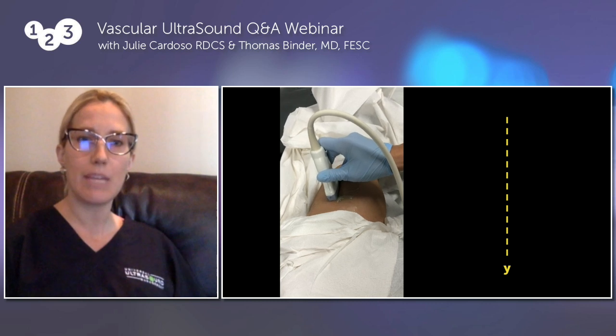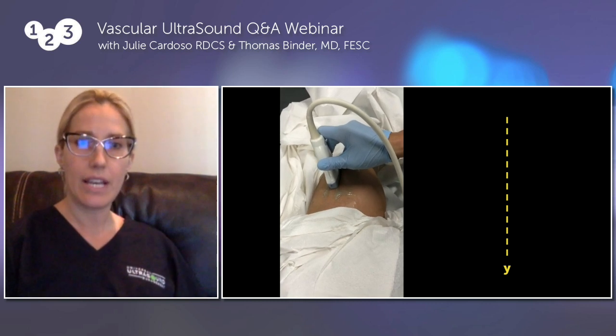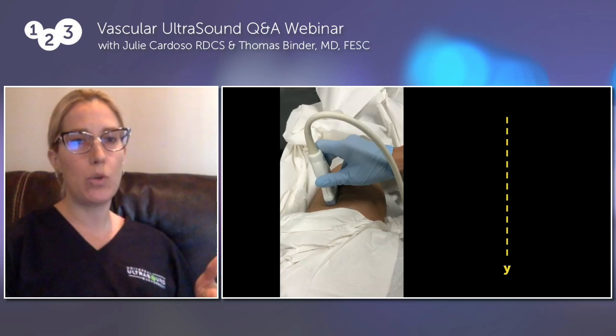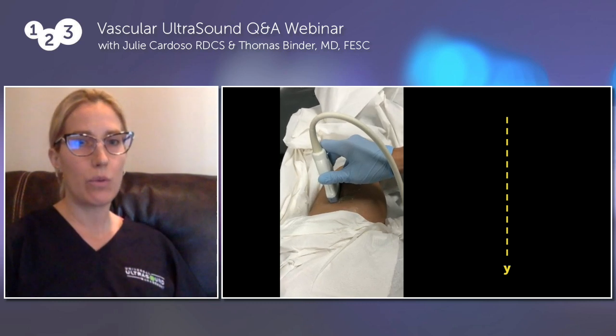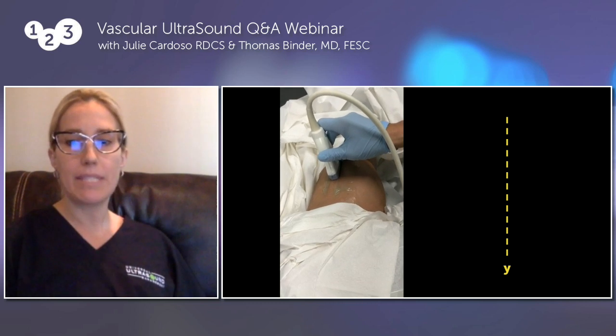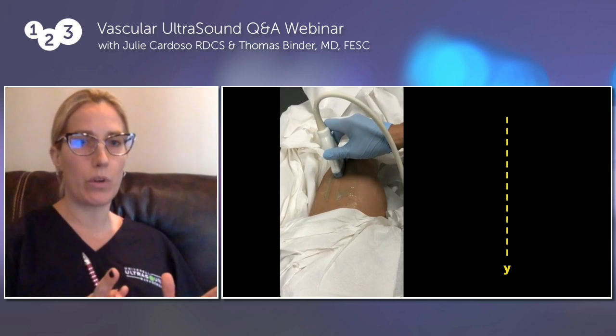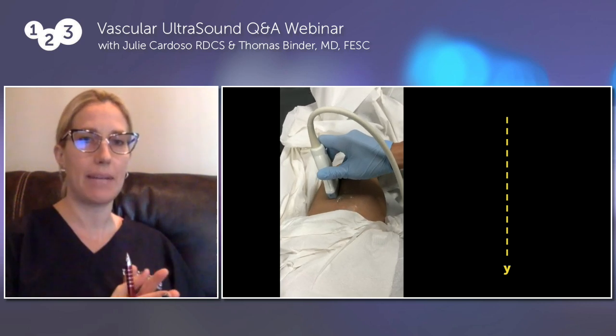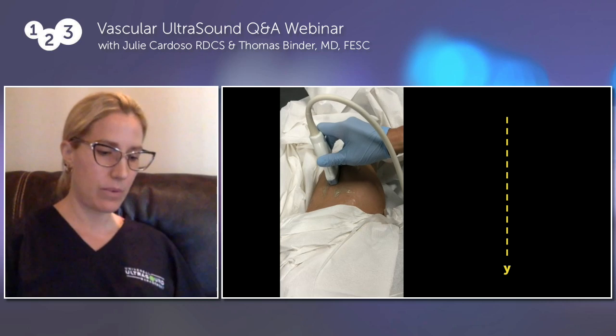So that's the Z axis. Here is an image of me sliding in the Y axis. If the vessel that I'm moving along, the leg, would be viewed in the longitudinal view. However, a common mistake is that we can mix it up when we're viewing veins, because they can often go in between the Y and the X plane.